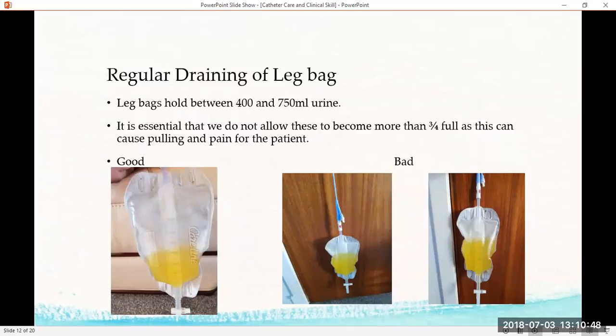I thought that, I know I'm obviously being thick, because I was under the illusion that if it was open too much, you could cause infection. All right, so what you're saying is that opening it too much could be a cause for infection. So you're trying to get that balance right between opening it too much, but making sure that it's emptied regularly.